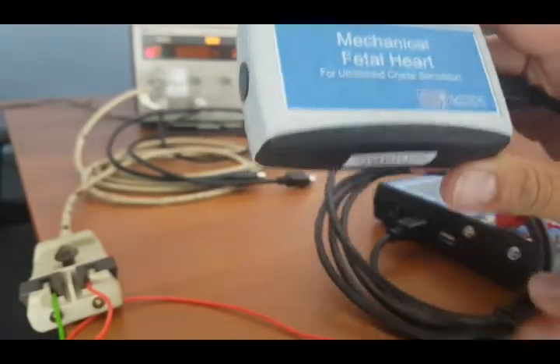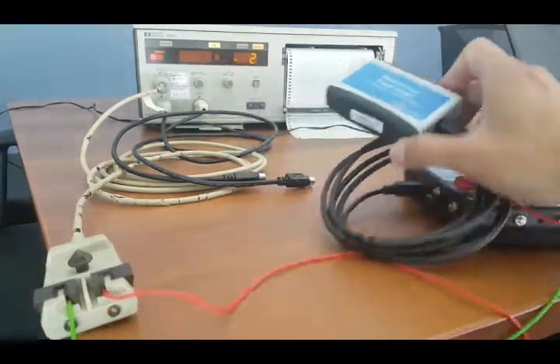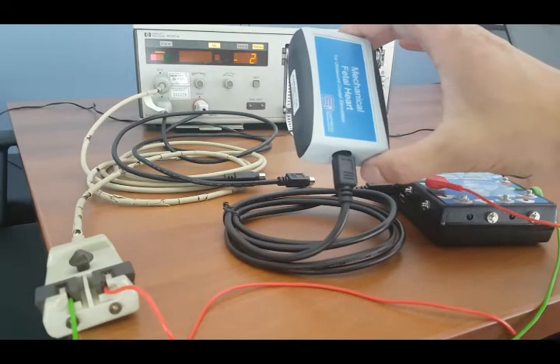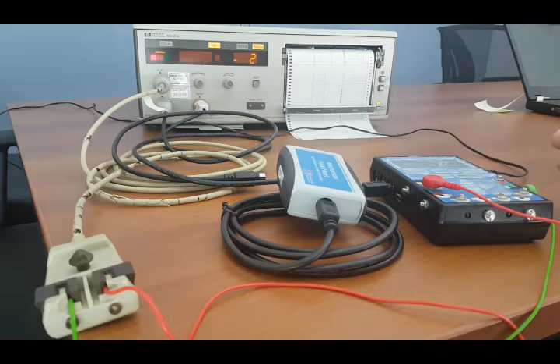And in an earlier video test, I was able to hear that from my speakers. So of course, this particular mechanical heart can work from all 3 ports. I will be sending you one of these mechanical heart simulators you can try out. And then we can discuss in terms of cabling that you would need to connect to your monitor.